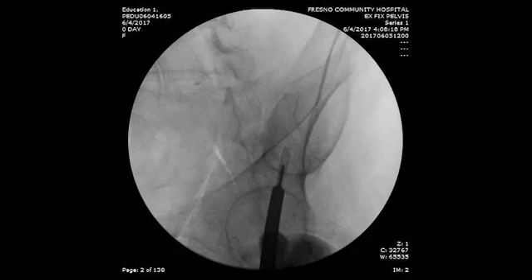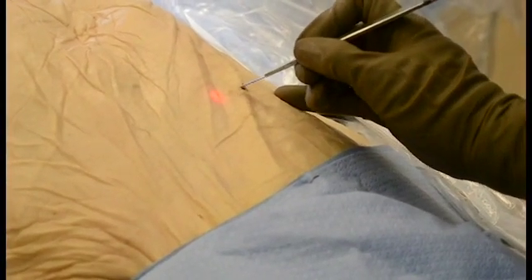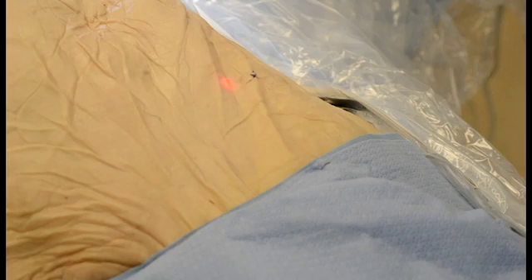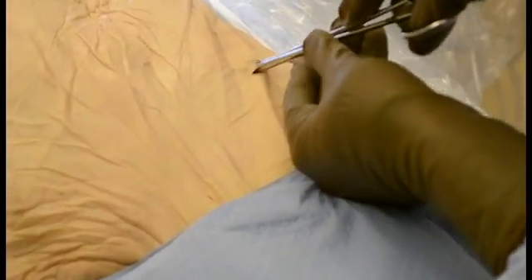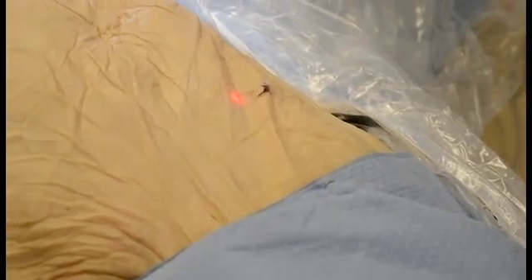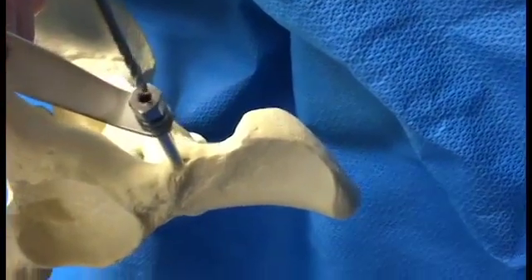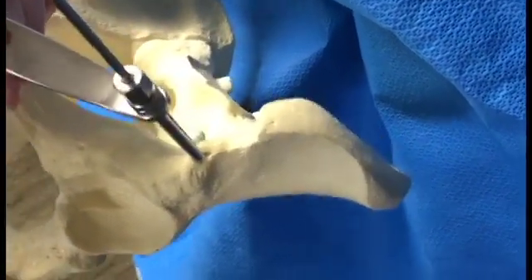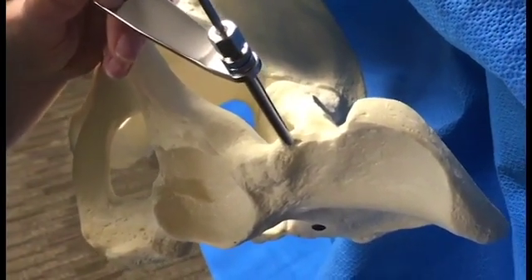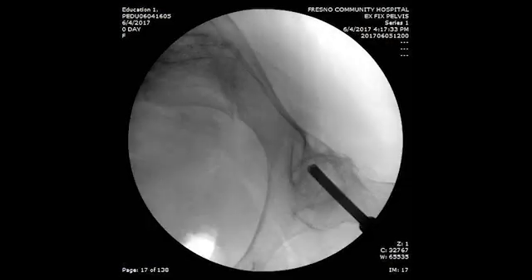Confirm start position with C-arm. Start on the obturator outlet or teardrop view to confirm your start point. Make a small stab incision with a 15 blade along Langer's lines that extends medial to the expected pin site to reduce soft tissue tension following reduction. Take care to avoid the lateral femoral cutaneous nerve. Using a blunt instrument such as a tonsil, spread soft tissue down until you are on bone. You will be going through rectus femoris tendon down to AIIS. You may also use the tonsil to help insert the triple sleeve guide. Insert the drill guide just superior to the AIIS, aiming toward the SI joint approximately 30 degrees medially and 20 degrees cranial toward the PSIS. Consider using a more superior start point aiming toward the sciatic notch for more patient-friendly positioning for the external fixator. Take care to avoid the sciatic notch. Keep in mind the pin tends to exit laterally out of the ilium and adjust your hand accordingly. Get the tunnel view again to confirm your start point with the obturator outlet, as well as the obturator inlet and iliac oblique views.